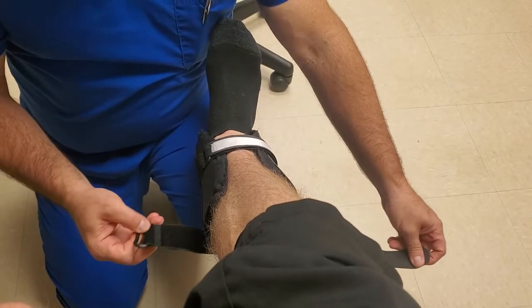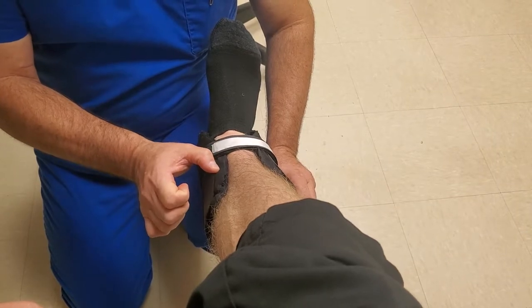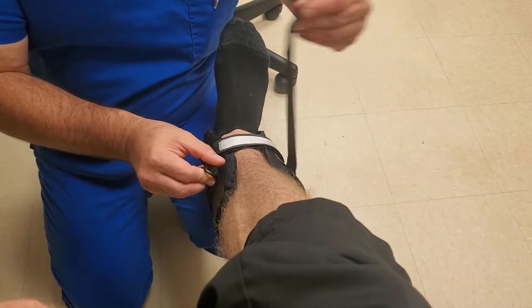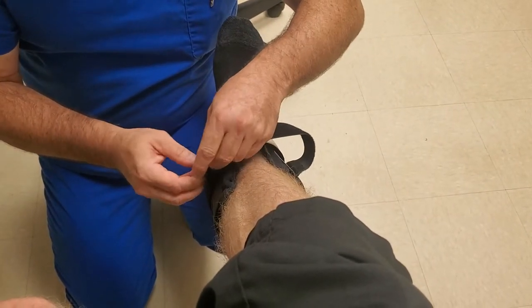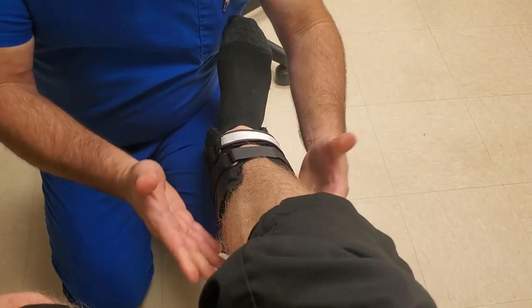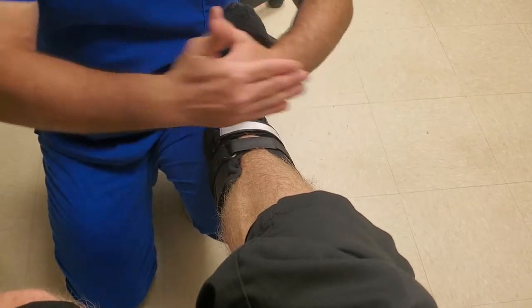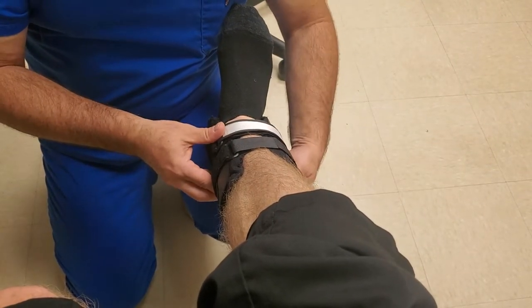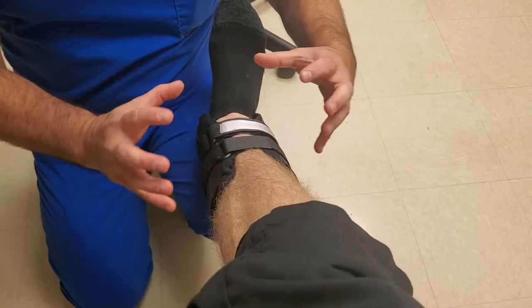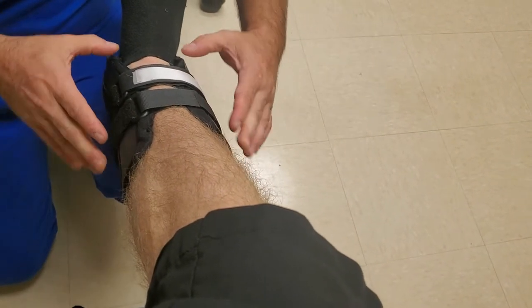You take the second belt strap about a thumb distance above — there's a little point right there, it's a good marker. Bring this around, velcro the buckle off to the side just like so, and put it on with just a little snug tug. It doesn't have to be super tight. In your imagination, as you're looking at it, it should look like a hashtag — two lines and two lines. It should fit nice and snug. You don't want to place the top strap too high up, because if you do that you create an A-frame effect and by cinching it down on the top it actually opens up the bottom.